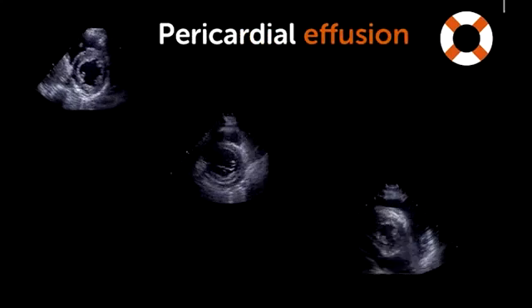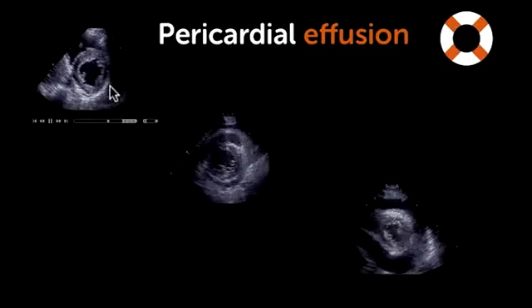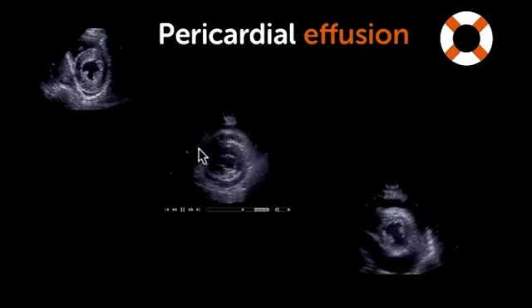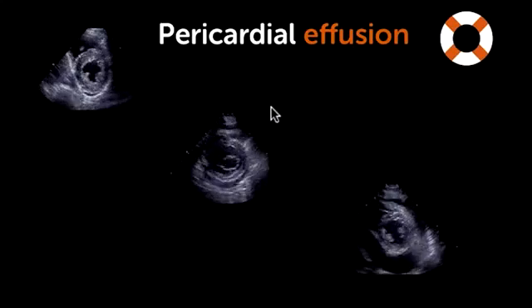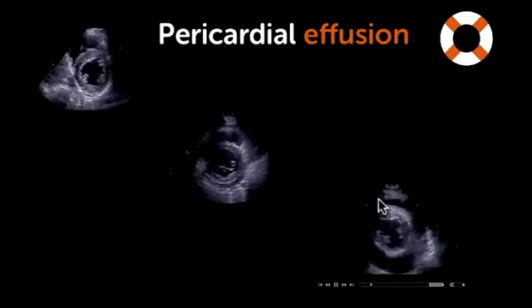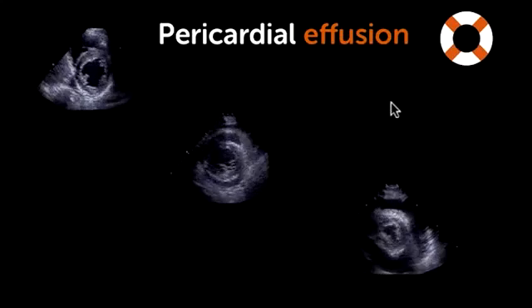But before I talk about tamponade, a few more examples. Small pericardial effusion just located in the inferior region. Bit larger, this pericardial effusion is circumferent. And very large. Note how the heart swings within the fluid-filled sac. We also call this swinging heart.